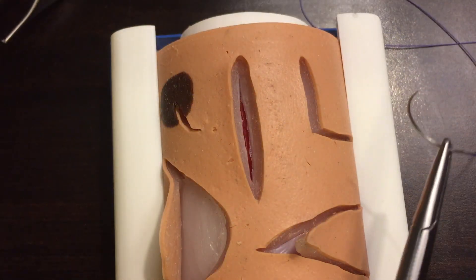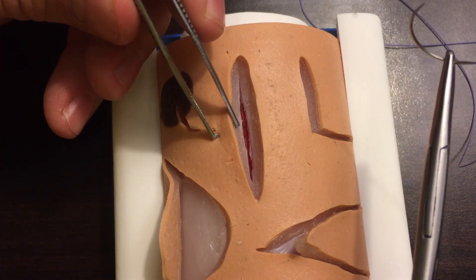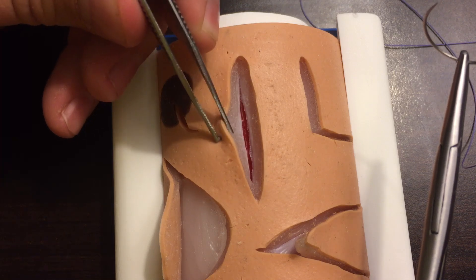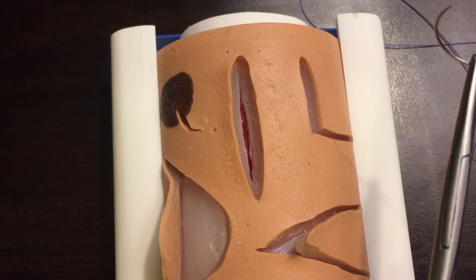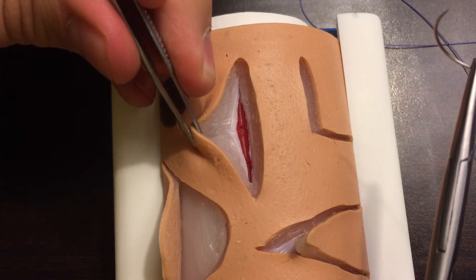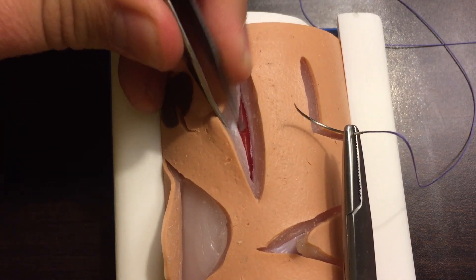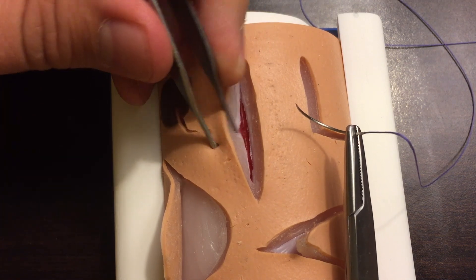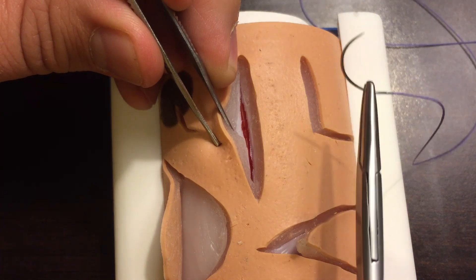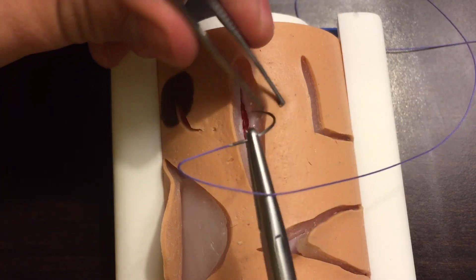Most often we're going to use something like a vicryl or another form of an absorbable suture. On our suture trainer here, with this surgical example, we do have the opportunity to suture some deep fascia. This is stronger tissue that's underneath our subcutaneous fat, and if we need to get a closure there we'll want to use some absorbable suture like vicryl.